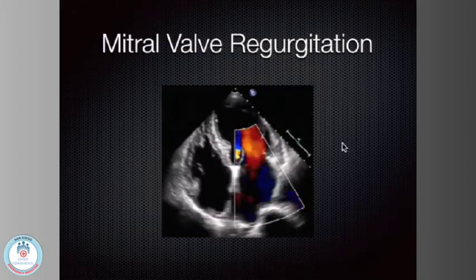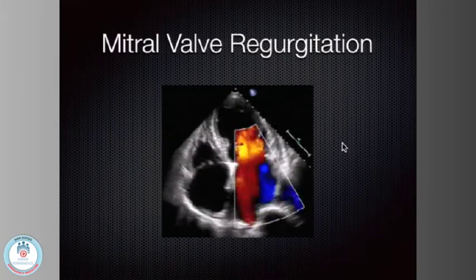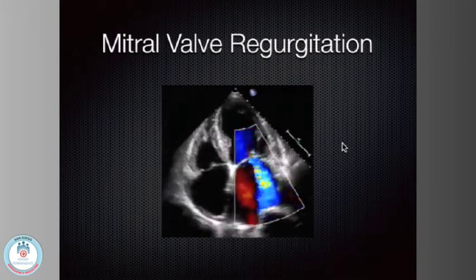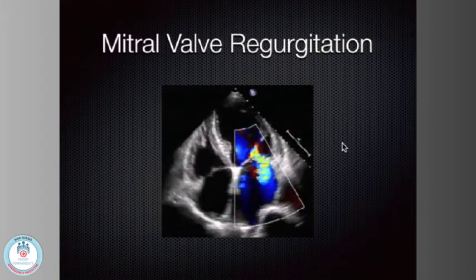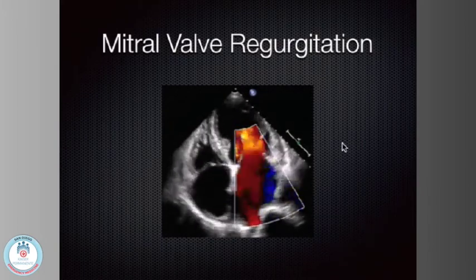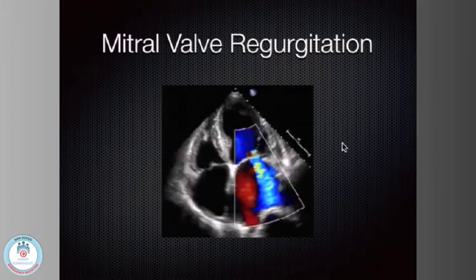And this is where color flow can be helpful. This is an example of mitral valve regurgitation. There's this thing called BART, blue away, red towards. And during the diastole and systole of the heart, B-A-R-T, blue away, red towards. And so what we're seeing here is during diastole, we're seeing that red jet come up into the left ventricle. But then during systole, unfortunately for this patient, we're seeing a blue jet back walling that left atrium. Do you guys see that? And so this is mitral valve regurgitation. It's severe, and that's about all I can tell you.